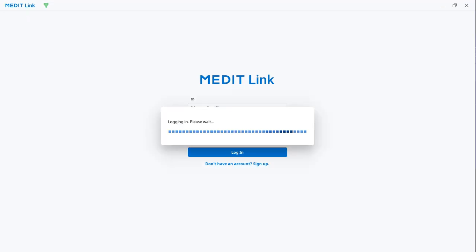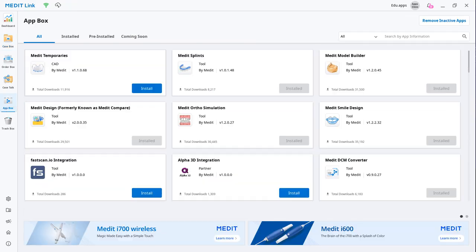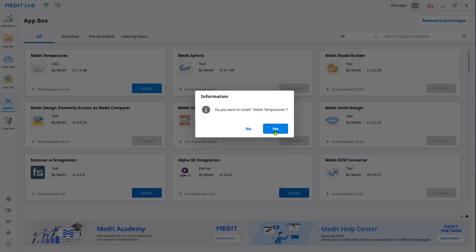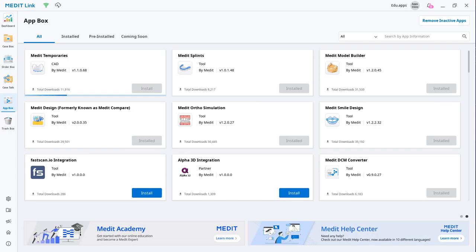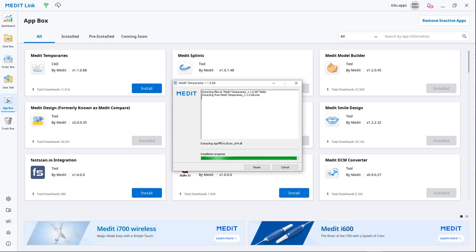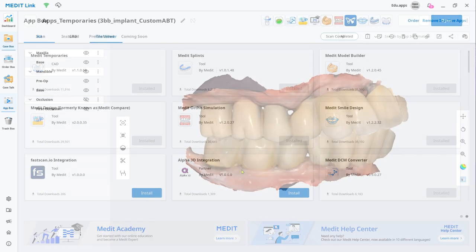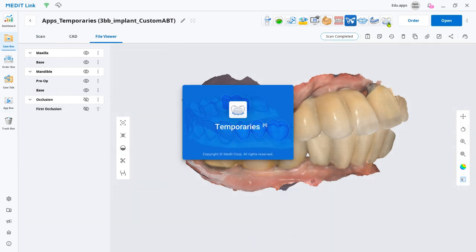Log in to your Medit link and go to the app box. Then find the Medit Temporaries app and click install. The installation file will run automatically once the app is downloaded. Once you have the data, run Medit Temporaries from the top.